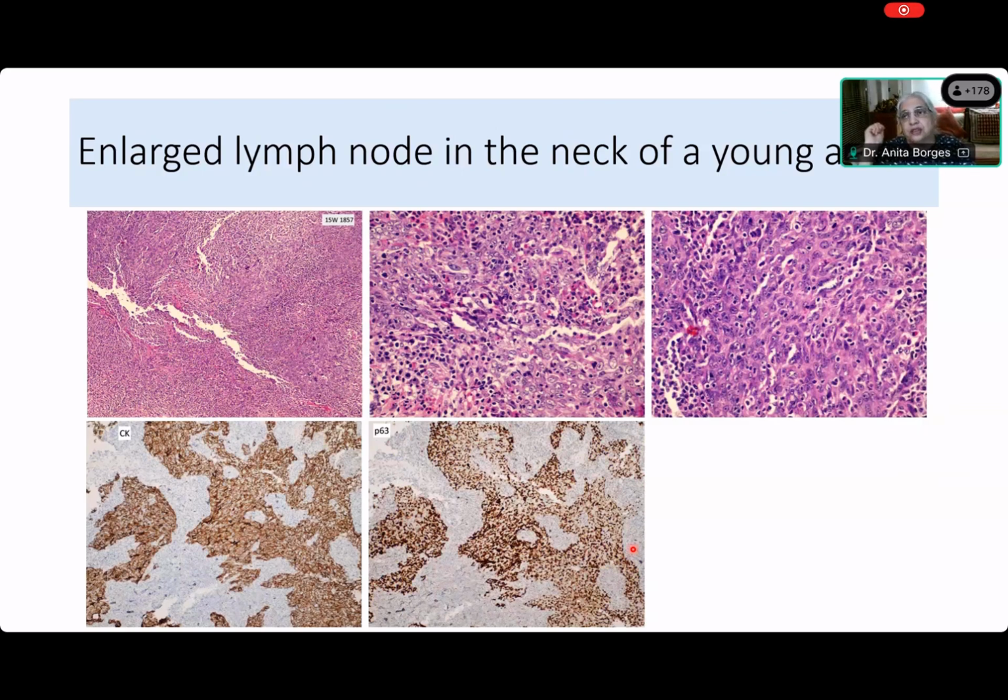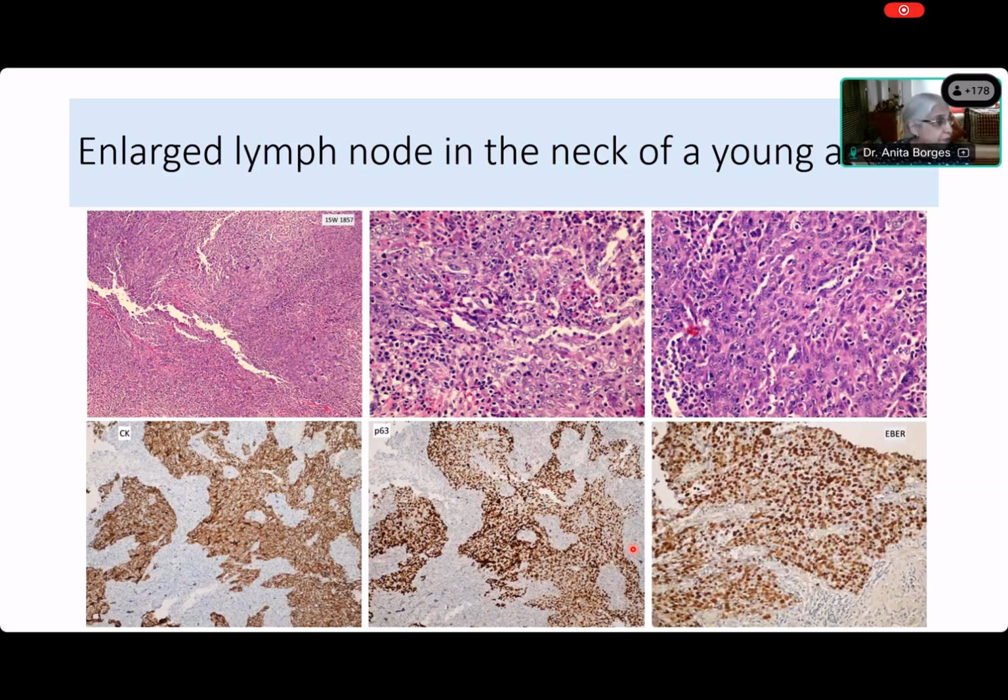So which is that? There are lots of people saying things in the chat box. Somebody said lung. I think that's terrible. Squamous carcinoma of the lung, no. Megha is saying something and others have said it before. It is nasopharyngeal. Nasopharyngeal carcinoma. And what would you do? You would do an EBER, and there you are. Or Epstein-Barr virus induced squamous carcinoma.